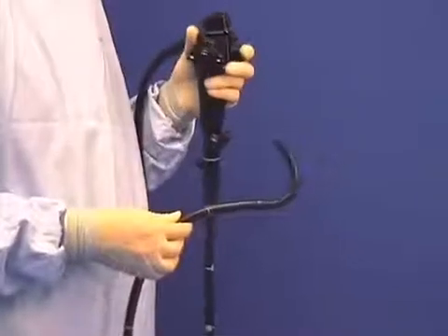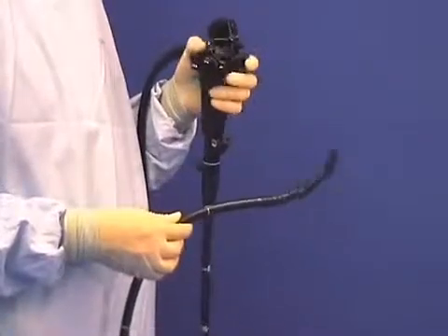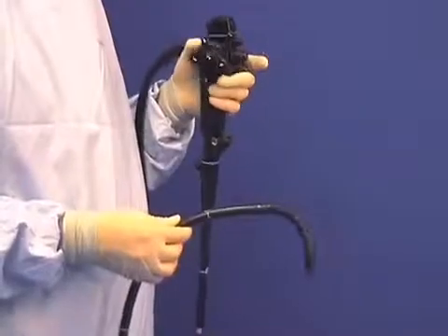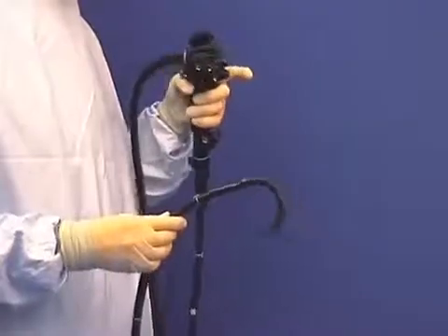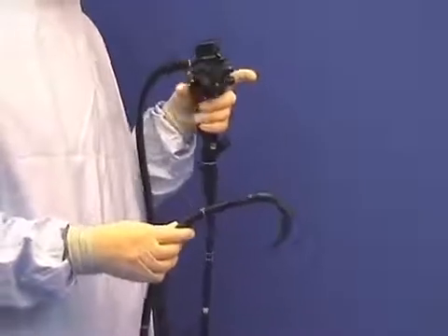Try the exercise of control knob angulation fully up and fully down many times, the middle finger helping the thumb. If the middle finger isn't available, this manoeuvre is either impossible or very difficult.